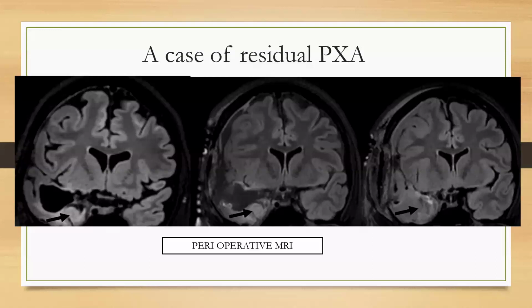Perioperative MRI means that usually after surgery, the patient will be taken directly from the OT to the MRI console immediately after surgery. But it will be very cumbersome to keep the MRI machine empty, and immediately after surgery, the patient will be taken inside.